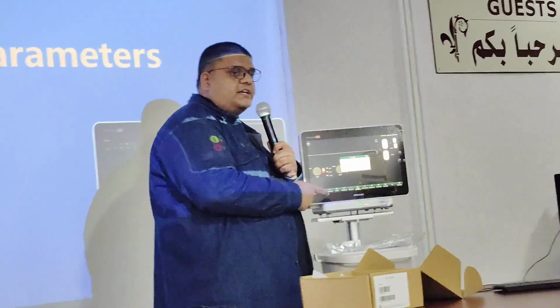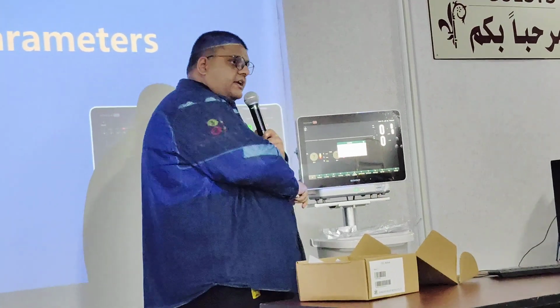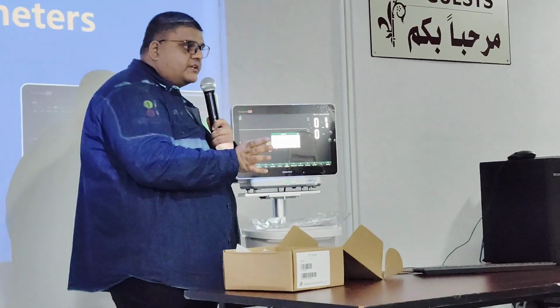Yeah, so it will work. Yes, but it will give you a warning and it will tell you that the patient doesn't match, okay? So the patient in here and the patient on the monitor, if they're different, the names or the patient ID, if any of that is different, it will alert you. And if you press OK, you know what is happening, then it's fine. So it will continue, but otherwise you can cancel it.